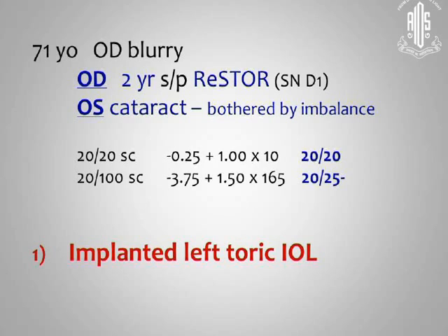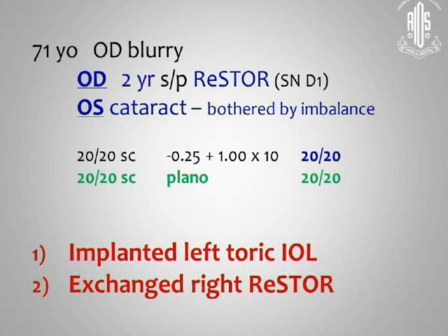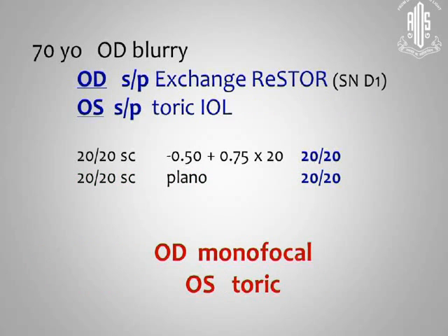And he called back in a couple days after the surgery, just a few days after surgery, says, I made up my mind. I don't want to have all of that the rest of my life. I know it's risky. I want you to try to take the multifocal out. So we went ahead and exchanged that. I won't show the video of that. We don't have time. But this is his vision now with the monofocal in that first eye.